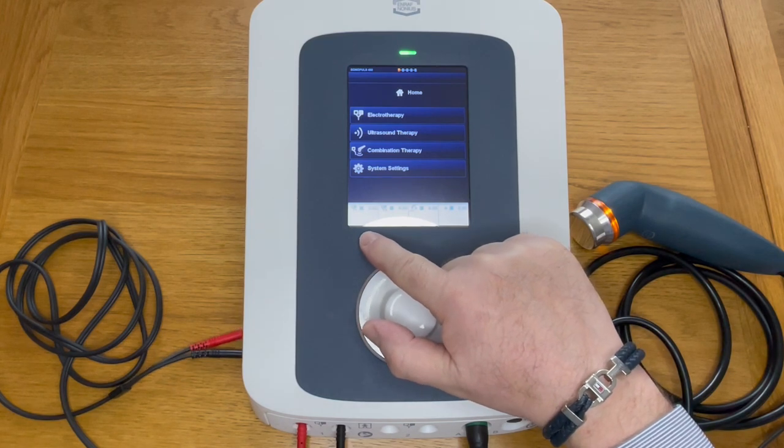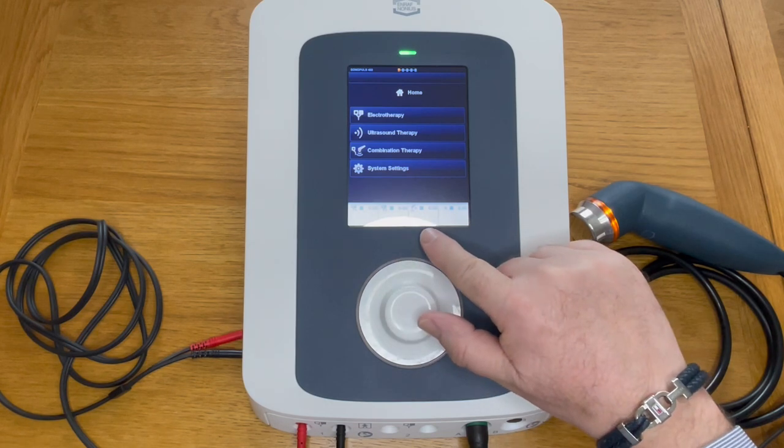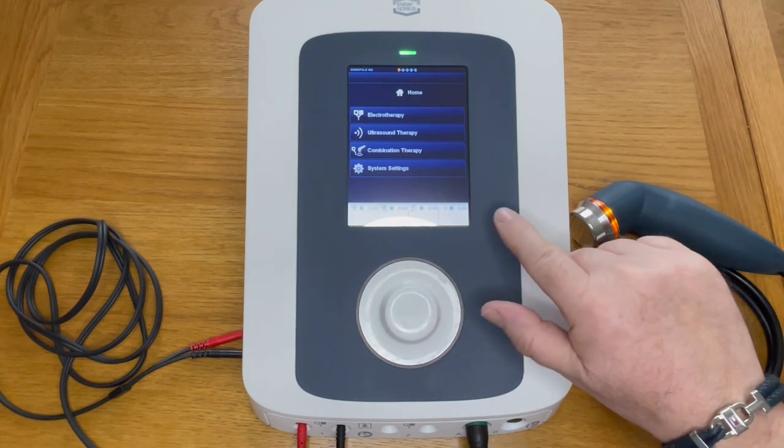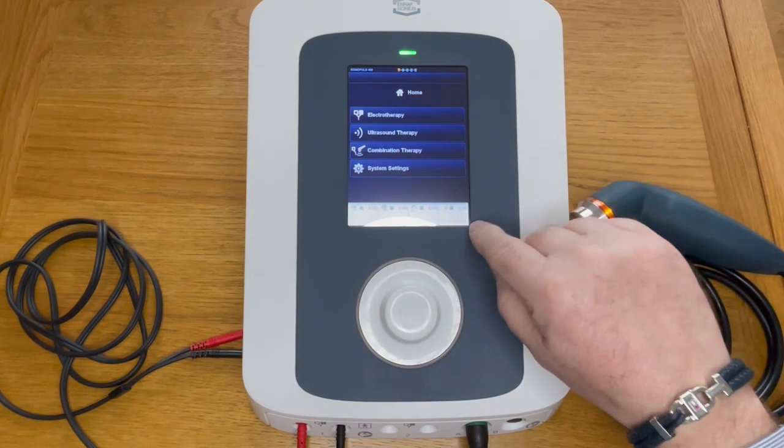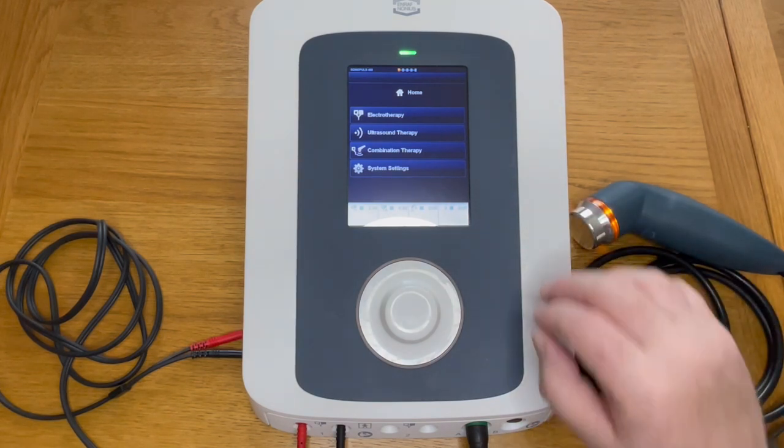We have electrotherapy, ultrasound, combination, and system settings. Below this you can see intensity for the electrodes for channel one, intensity for channel two, ultrasound, and timer. This is channel B of the ultrasound, should you have a second head.